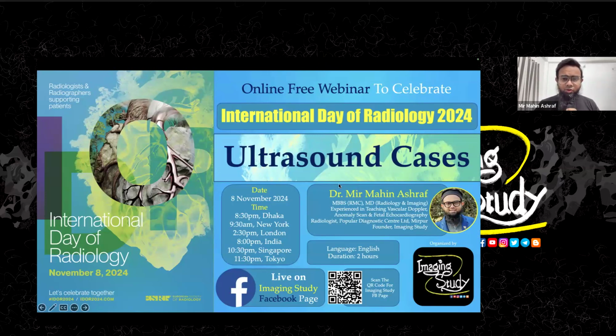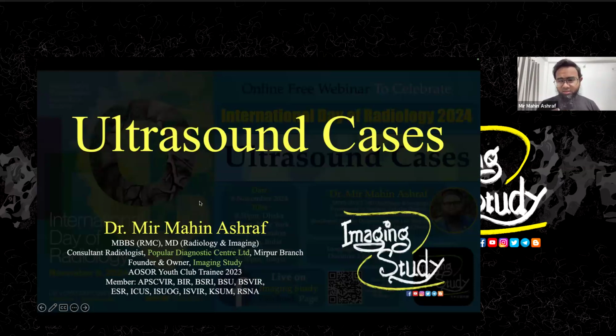So today we will talk about some ultrasound cases that come in our regular practice, and it will be a 2 hours long session, I hope. We'll try to share 25 ultrasound cases with you of different topics, different scenarios will be given. I hope the next 2 hours will be enjoyable for you, but I'm not sure because some cases are a little bit confusing or boring maybe. So anyway, let's start.